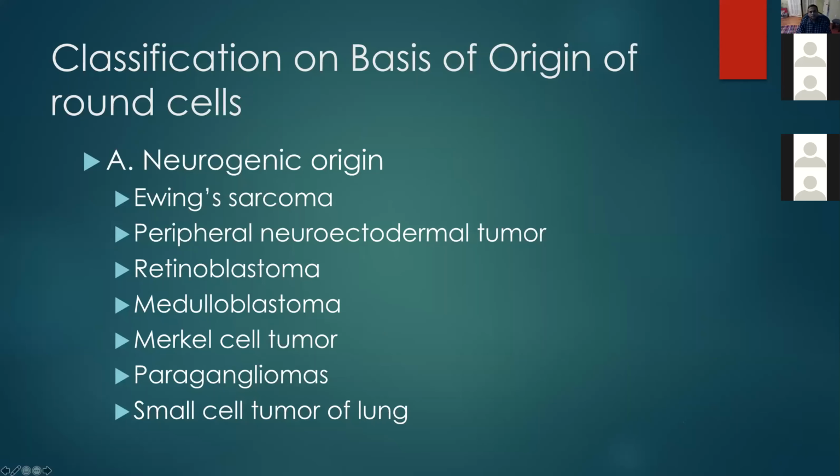I don't want you to get completely blown away, but do remember, how do you distinguish neurogenic origin? A simple immunohistochemistry, S100. There are other things, synaptophysin, chromogranin, but S100 is one of the oldest, almost 100 years old. Since the 1950s, or even before that, S100 protein, which we know marks neuroendocrine.